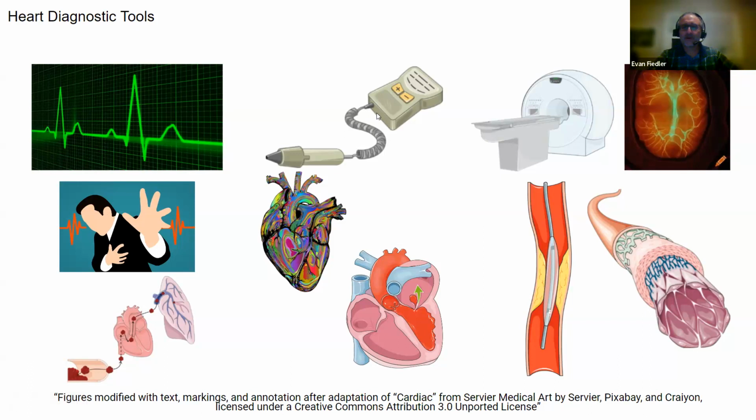Ultrasound, echocardiogram, cardiac volume, which will give us an idea of cardiac output, and structural defects. And again, this is showing mitral valve prolapse. MRI, magnetic resonance imaging, with positron emission tomography, atherosclerotic plaques. Computed tomography, coronary artery anatomy.